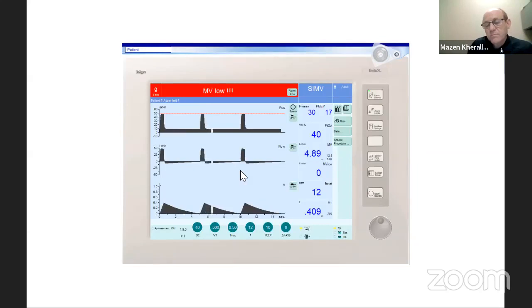Yes, what question is that? Regarding severe bronchial asthma, it's not like ARDS, except that we have the patient with a pH maybe 7.1. Okay, so my priority now is to increase the RR and prevent auto-PEEP, because at 7.1 it will be a risk after getting sodium bicarbonate. Is my opinion correct or not?